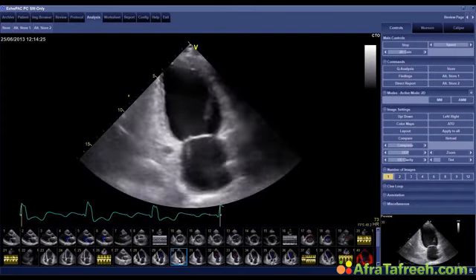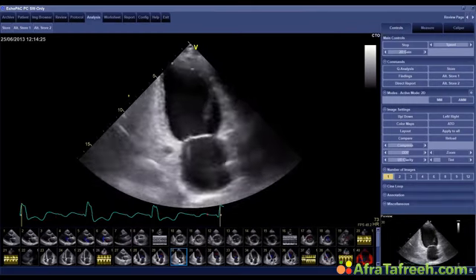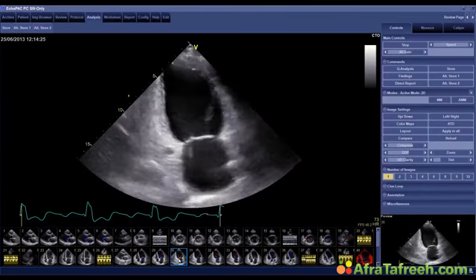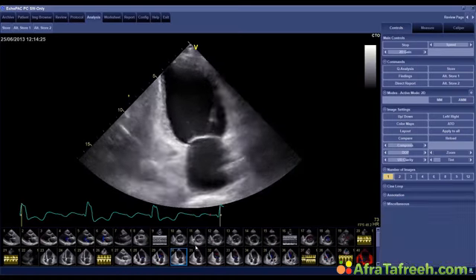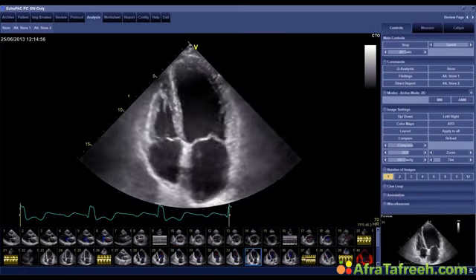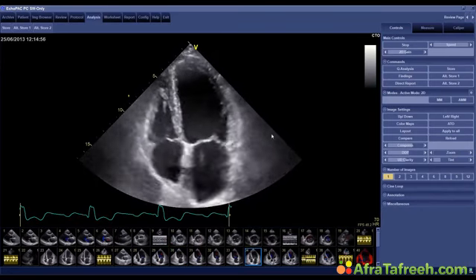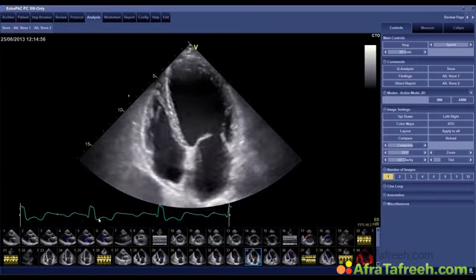But does the ejection fraction really give you the information about prognosis? I'm well aware of the fact that ejection fraction correlates with all sorts of prognostic parameters. But in this individual case, I think we have to look at a few other details. The first thing I'd look at is the motion of the myocardium. If you look closely, you will see that it's not completely synchronous. There is some degree of dysynchrony here. And if you look at this here, you see that the patient has a bundle branch block.